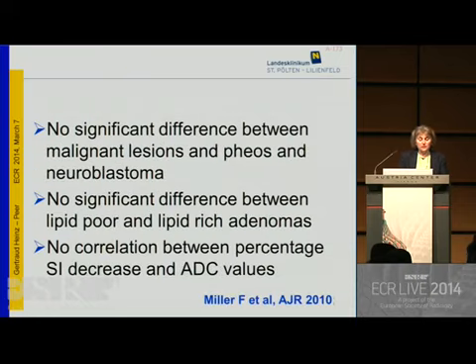Also no significant difference between malignant lesions and pheochromocytomas and neuroblastomas. No significant difference between lipid-poor and lipid-rich adenomas. So we cannot differentiate between lipid-poor and lipid-rich. And there is no correlation between the percentage signal intensity decrease and the ADC values.